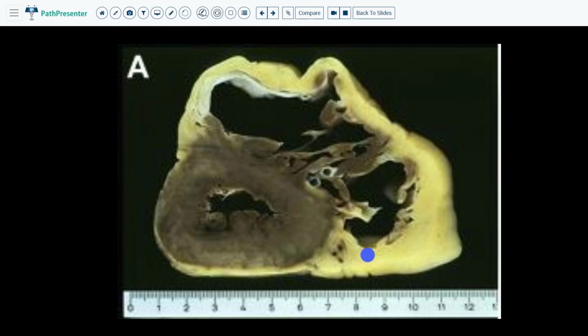This is autosomal dominant and is caused by various mutations that affect desmosomal proteins. These desmosome mutations affect cell-cell adhesion, and this can lead to myocyte death and fatty replacement. Please note that adult hearts will frequently have adipose on the right ventricle. However, underneath the adipose, there will be normal myocardium, unlike what we are looking at here, which is almost all adipose. Okay, let's go on to our summary slides.